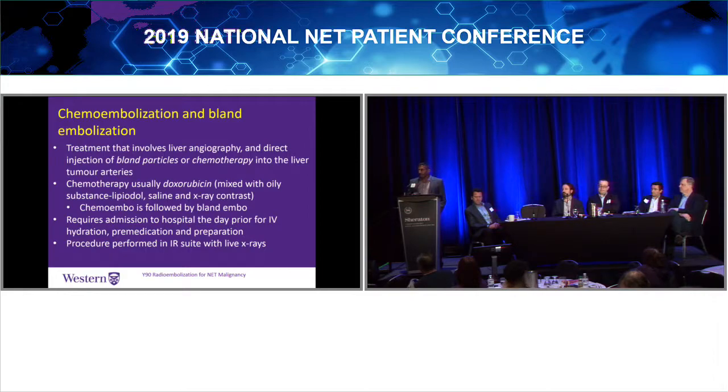And typically, and everybody does this differently, some centers will do this as an outpatient procedure. We do it as an admission to hospital. We tend to admit people the night before, get them ready and optimized, do it the next day, and then people will tend to go home the day after. And we do it, obviously, in the interventional radiology suite with live x-rays.